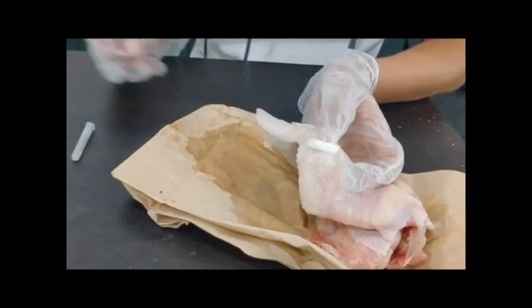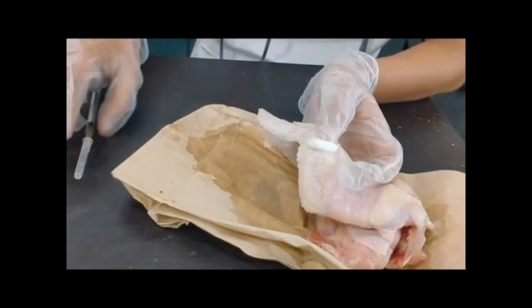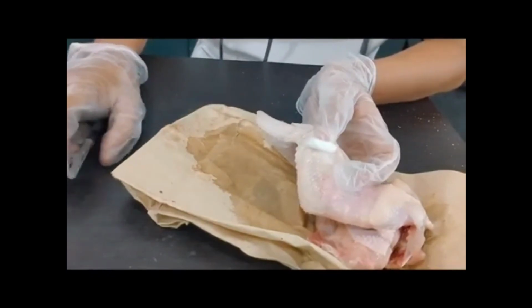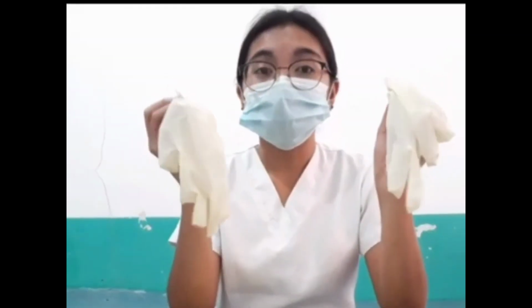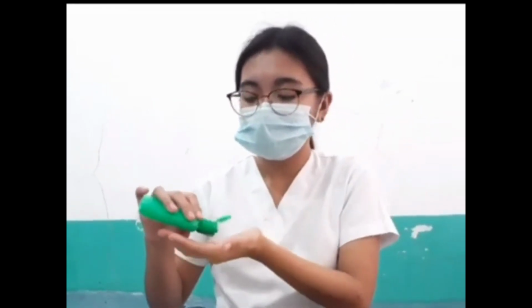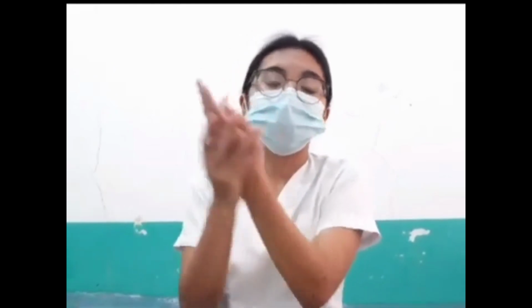Alright. And then, put some cotton. Then, place it in a container. So now I remove the gloves. And then, hand hygiene. That's the end of our process on how to do the intradermal injection for our patient. Thank you.